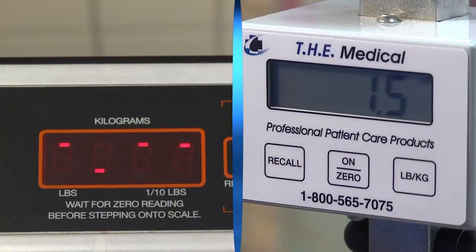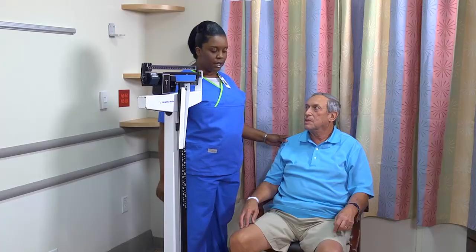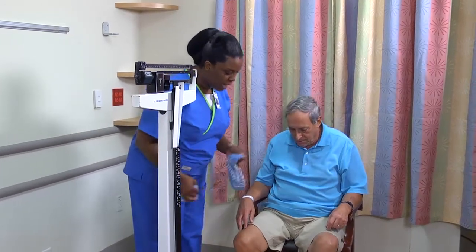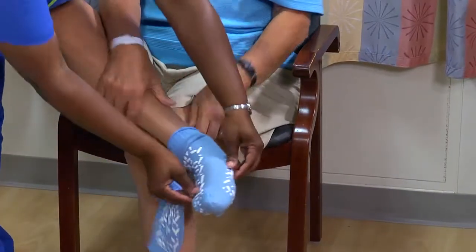Weigh the patient on the same scale at the same time of day and wearing the same type of clothing each time. Explain that you're going to measure his weight and height and that you'd like him to void before you weigh him. Be sure the patient is wearing lightweight clothing.